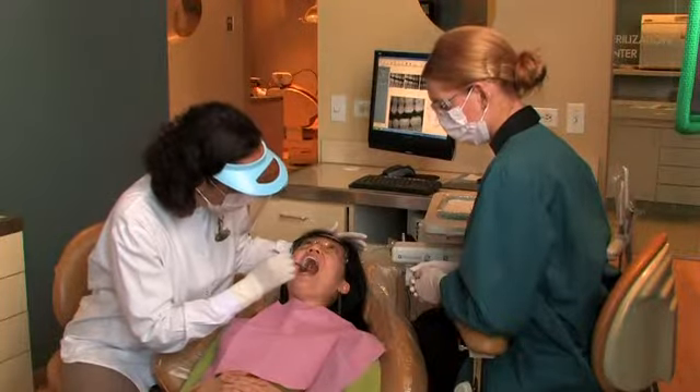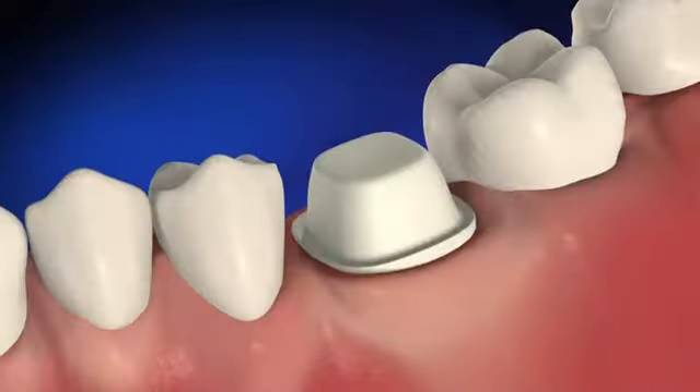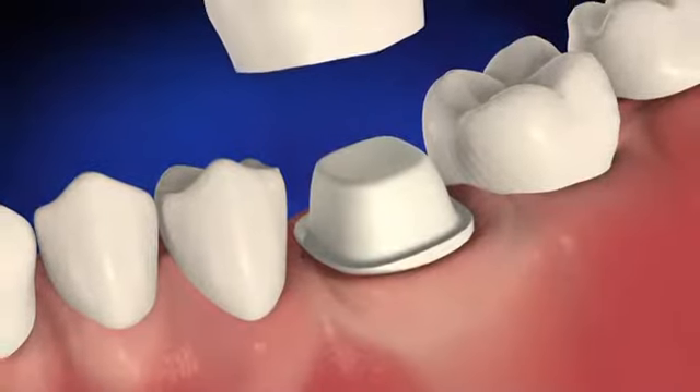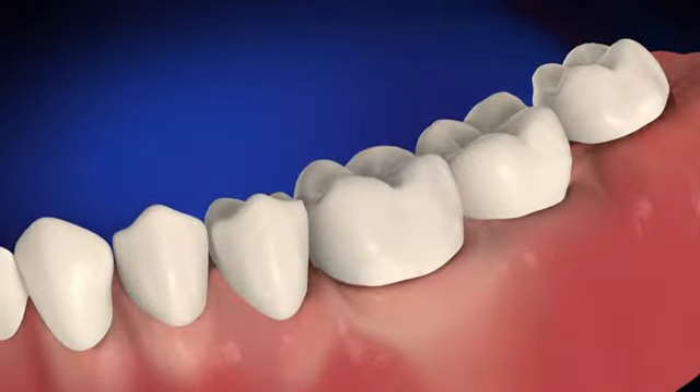Once your dentist has determined that a crown is best for you, there are several steps necessary to complete the treatment. Typically two dental visits are required. Your dentist will begin by preparing the tooth for the crown, which is done by removing the outer portion of the tooth to accommodate the thickness of the crown. Next, an impression of the prepared tooth is made.